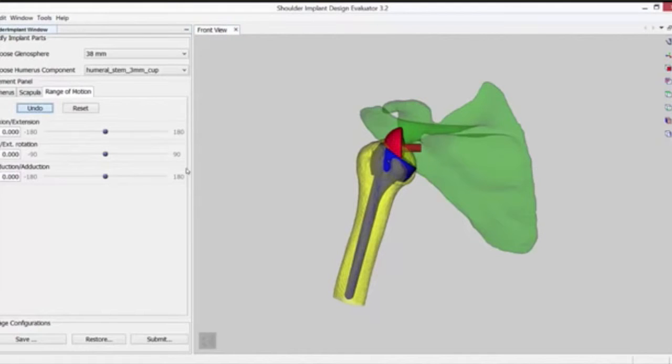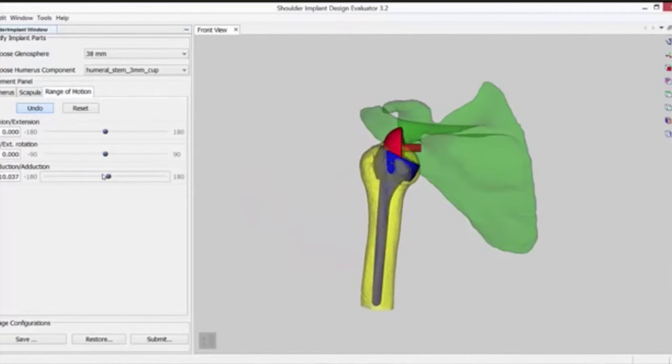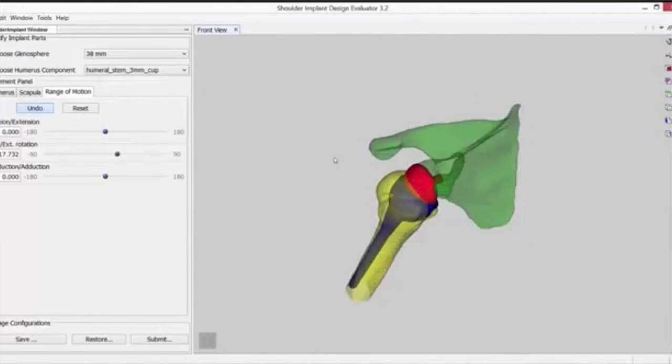Basically, you could take a specific patient anatomy and navigate the various implant options out there and position it in the ideal spot for that particular patient, which can optimize kinematic function, maximize the possible functions that are available to that patient. And the hope is that the outcomes will be better with that improved function, and that the implant will last longer, the patient will be more productive, and the hospital will have less revisions.